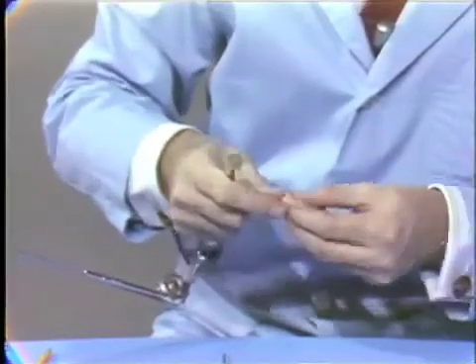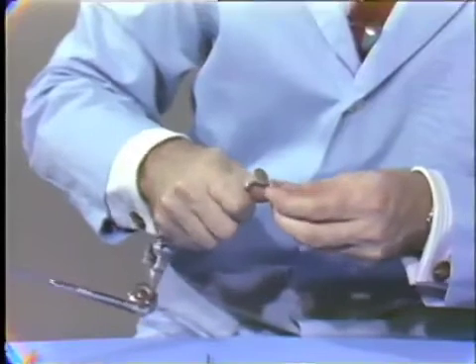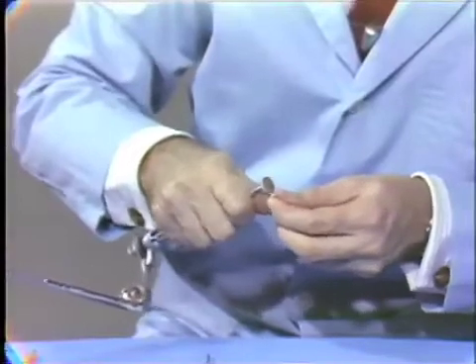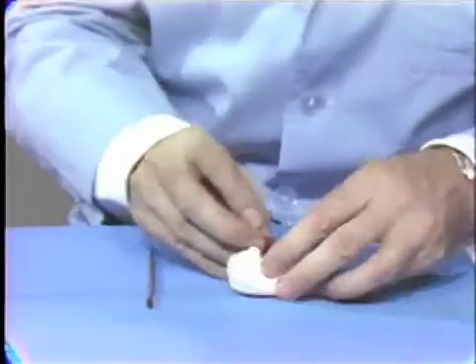And if you grind too much away here, you can fracture the facing, so you have to bear that in mind. So the whole surface here is rendered convex in all directions and rounded off nicely with the grinding stone. Now let's take a look at it now and see what we've achieved in doing that.